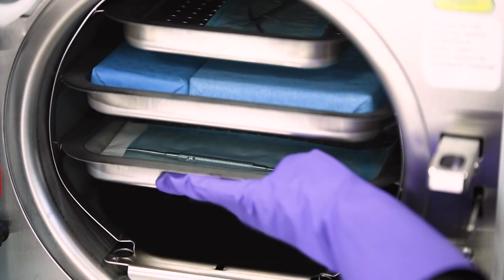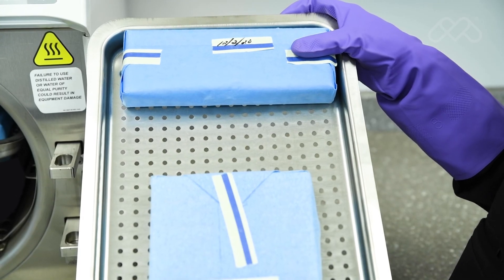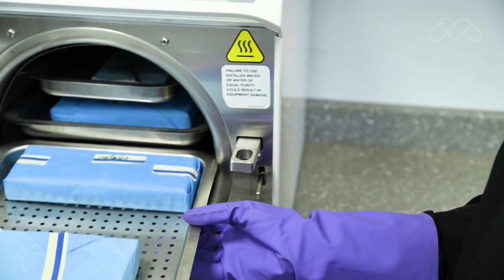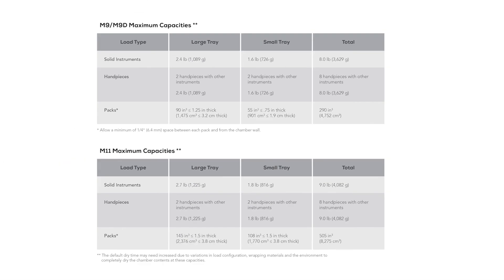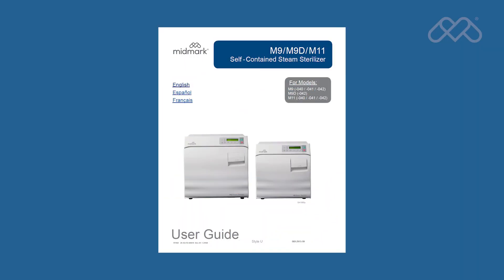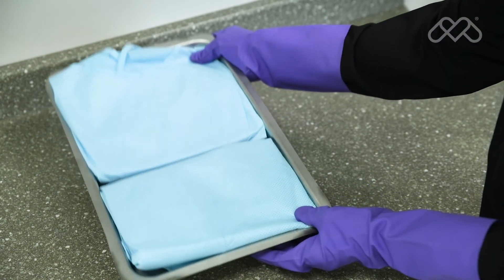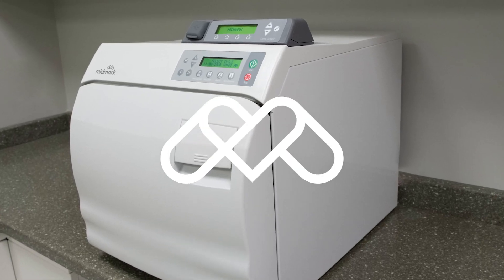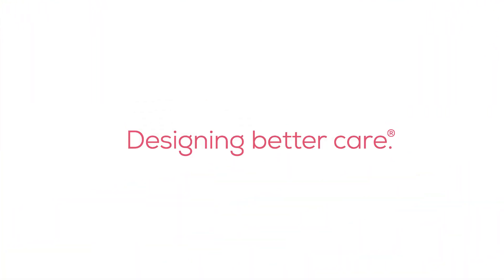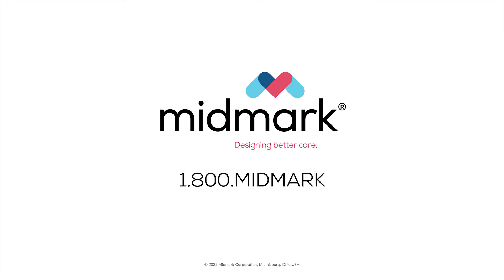Successful sterilization is dependent upon correct loading of the sterilizer. Do not overload the sterilizer chamber; adequate space must be maintained around all items to assure proper steam circulation and adequate drying. The maximum capacities tables in the user guide are provided as a reference, but maintaining proper spacing between all items should be the guiding factor in determining the maximum load. For more detailed information, refer to the M9-M11 user guide or contact Midmark Support Services at 1-800-MIDMARK.